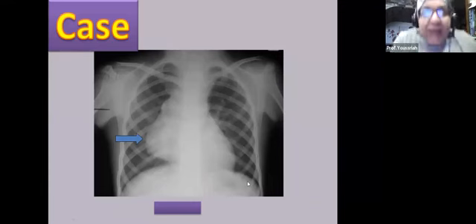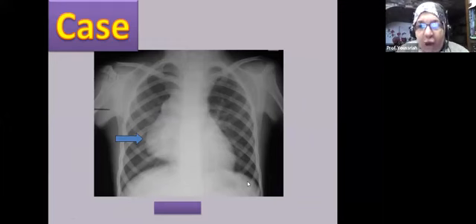We go to another very important point. How, in a plain X-ray, can we state that this is a mediastinal lesion? What are the criteria of being a mediastinal lesion in plain film? Number 1, to find a lesion that abuts the mediastinum, and medially it cannot be demarcated from it. It merges medially with the mediastinum, and laterally it is sharply demarcated. If we find such a lesion, this is a mediastinal lesion.